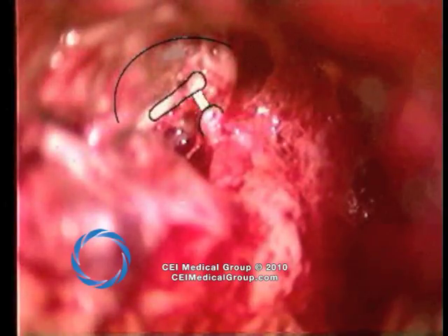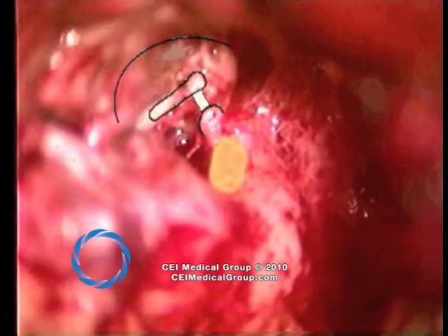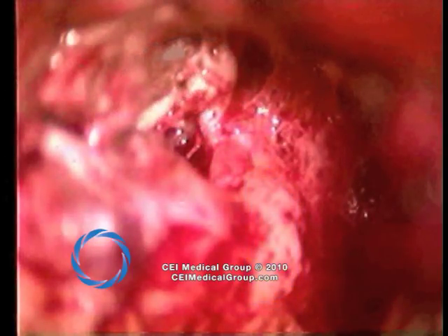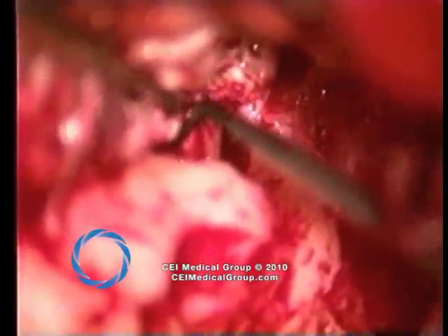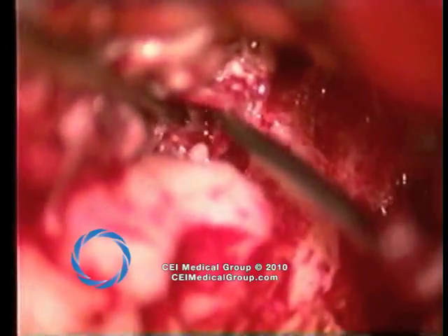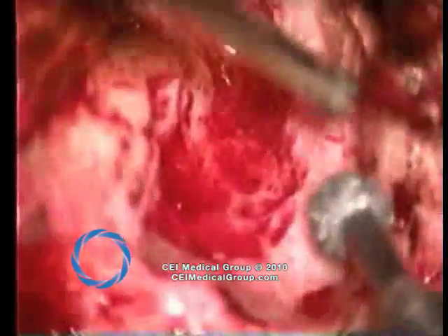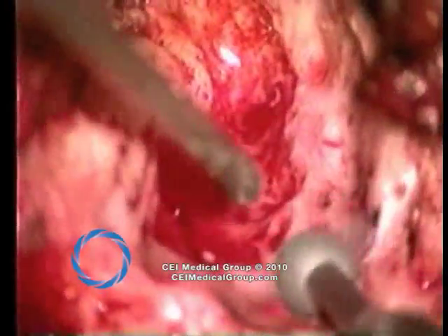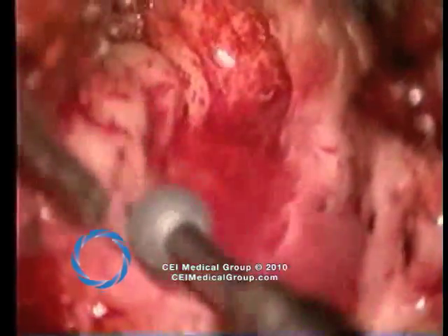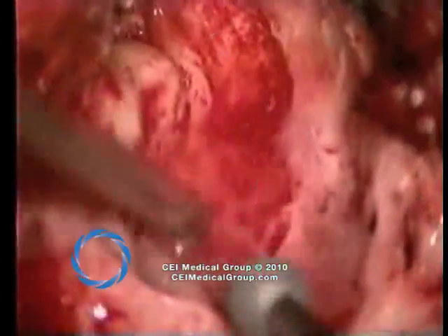Demonstrated are the malleus handle and the anterior sulcus of the tympanic membrane, as well as the tensor tympani cochleariform process, dehiscent facial nerve in yellow, and the lateral semicircular canal in blue. Tissue is removed from the oval window and in this case the capitulum of the stapes is visible. An extremely important portion of the procedure is removal of a margin of bone with a diamond burr in order to ensure that all epithelium has been removed. Use of the diamond burr also removes all mucosal coverings and allows the bone pate to contact raw bone, thereby facilitating healing.